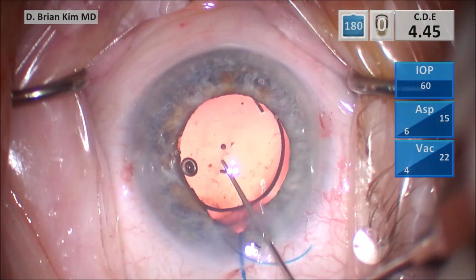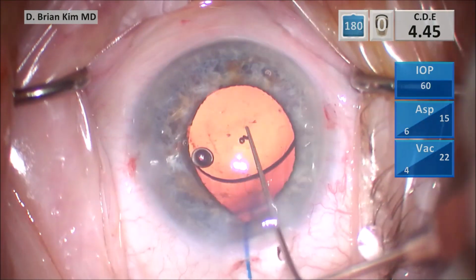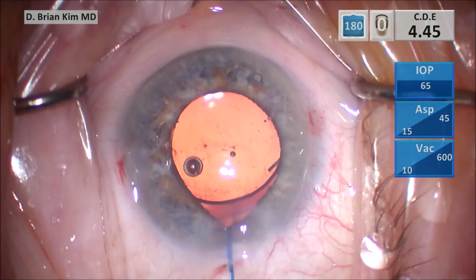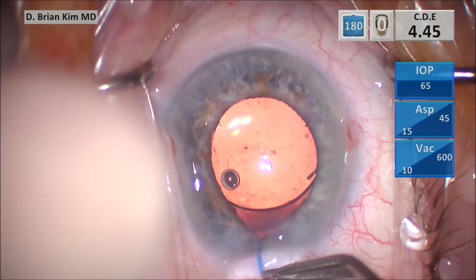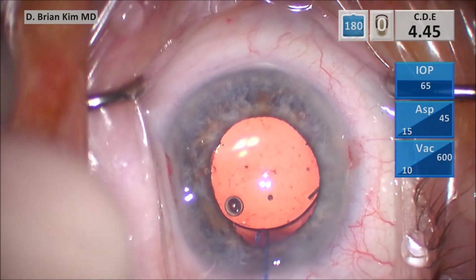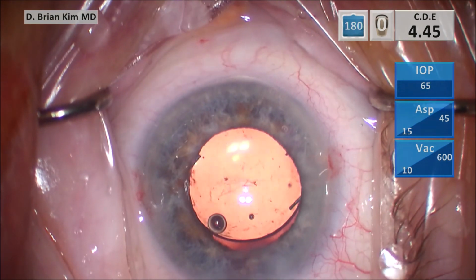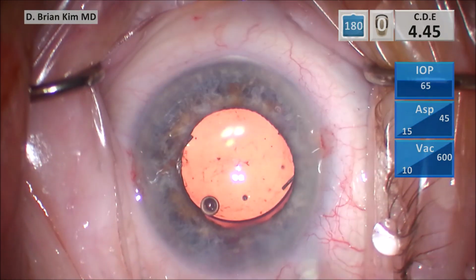So again, when you're trying to deliver the lens, if the viscoelastic is coming out too much, don't hesitate to push more viscoelastic in, because you want a fully inflated bag when you're putting the lens in. If the bag is collapsed and you push the lens in, you can have a tear in the capsular bag. So I'm carefully taking that iris hook out, disengaging it from the pupillary edge, and then pulling it out. So I had to widen my incision. I have to be very mindful of iris prolapse here.